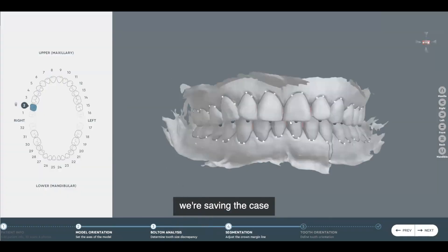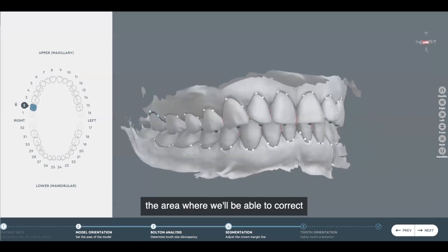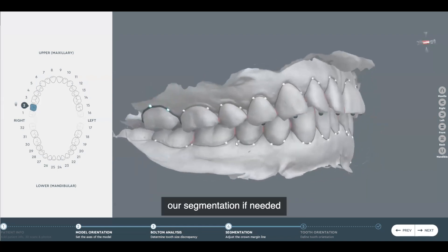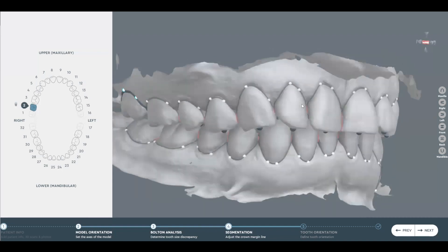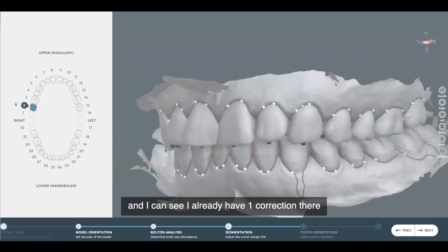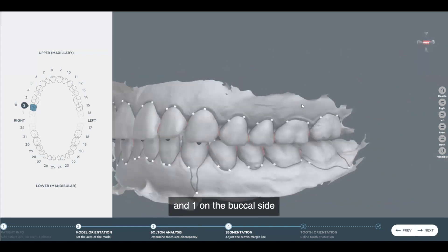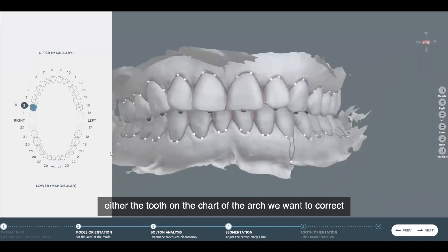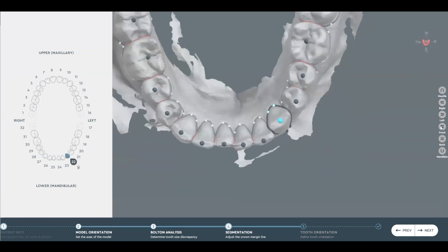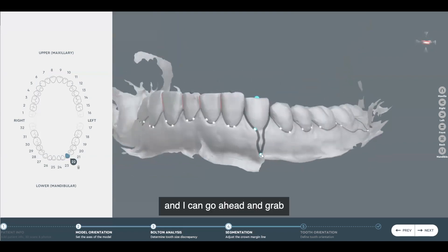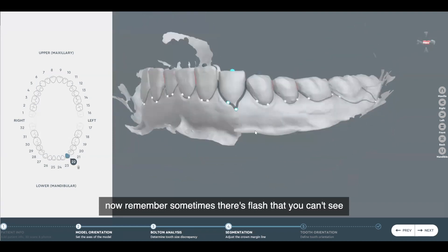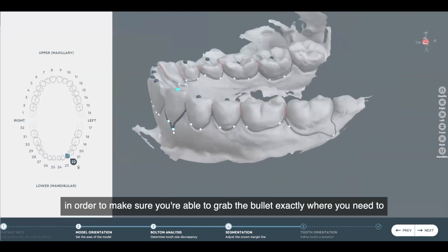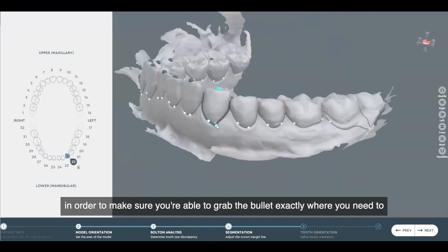In the next step, the software takes into account the landmarks and segments the crown from the tissue. We'll also be able to make any corrections to the segmentation if needed. The timeline is always letting us know what's happening. It opens up into the area where we'll be able to correct our segmentation. We'll evaluate our upper buccal and lower buccal areas and the facial. I can see I already have one correction there and one on the buccal side. To make the correction, we simply choose the tooth on the chart or the arch that we want to correct, and it'll select. Sometimes there's flash you can't see, so you need to rotate in order to grab the bullet exactly where you need to.